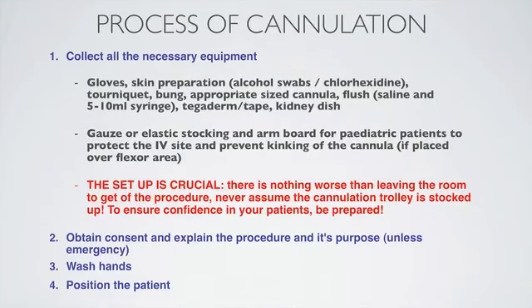And this is probably the most important point of this process, that the setup is crucial. This is because there's nothing worse than leaving the room during the procedure to get additional equipment that you've forgotten because you didn't collect all the necessary equipment. And never assume the cannulation trolley is stocked. This is really important to ensure confidence in patients, so be prepared.